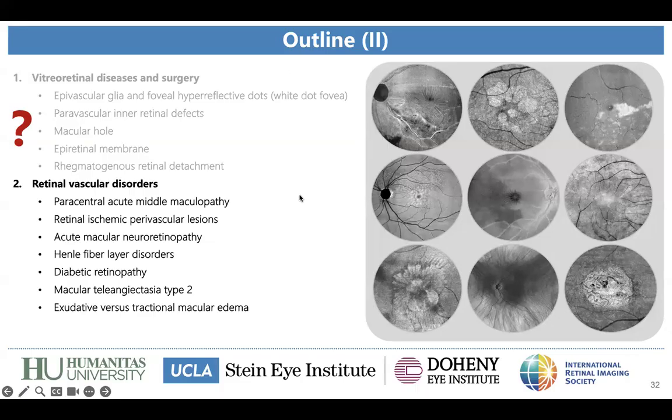Well, Alessandro, you made a great assembly of so much information, applicability and great images. One thing that I have in mind: en face OCT has existed since whatever, and I think it gained attention when OCTA took it to the spotlight.